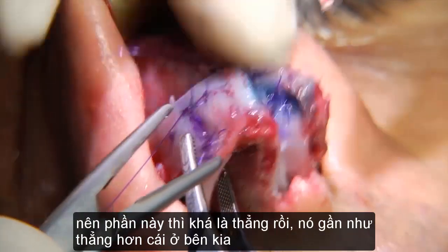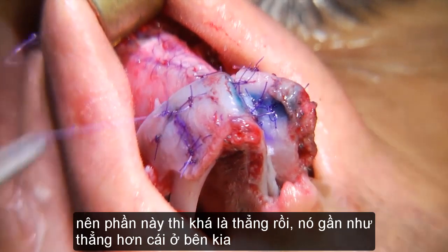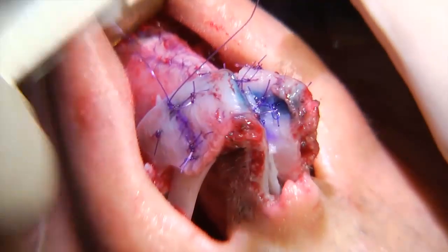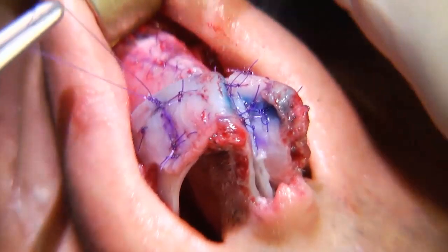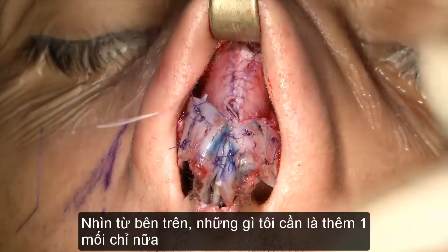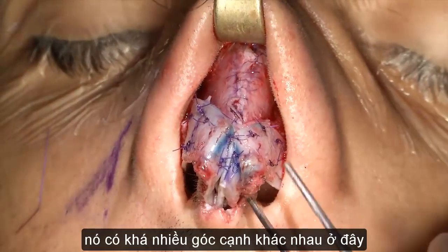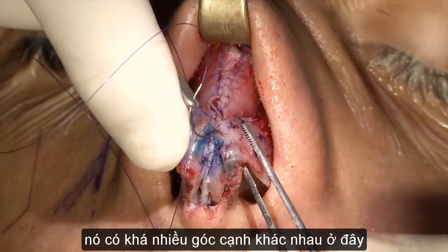Okay. So this is really rather straight. Actually now it's almost straighter than the other one. Good. Seen from above, all I need is one more suture because there's a different angle here.